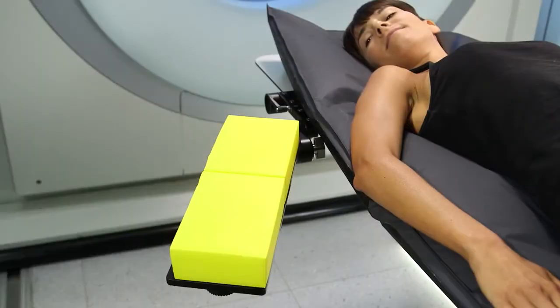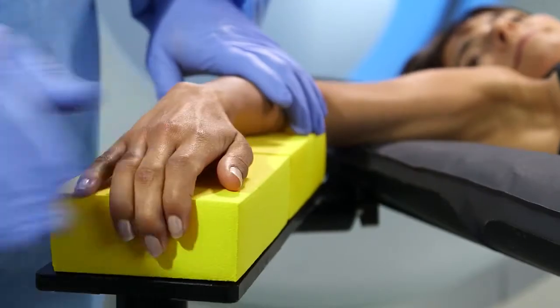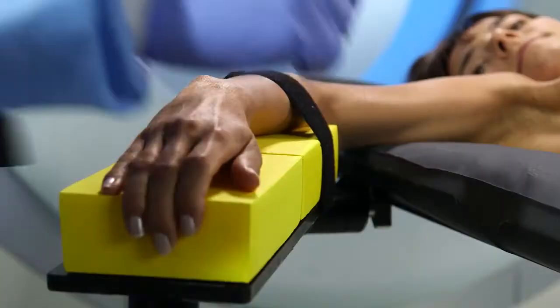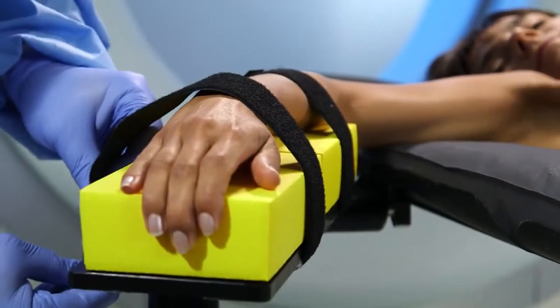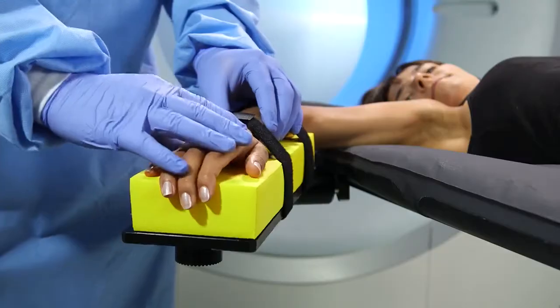For an optimal clinical outcome, many procedures require effective patient stabilization during imaging and intervention. The most common options for stabilizing patients are straps or tape. However, such methods result in patient discomfort and inadequate stabilization.